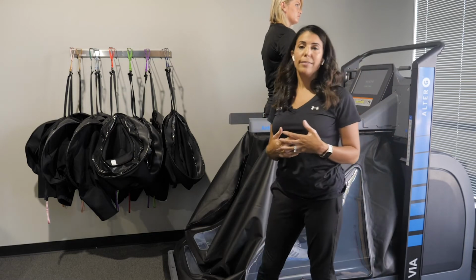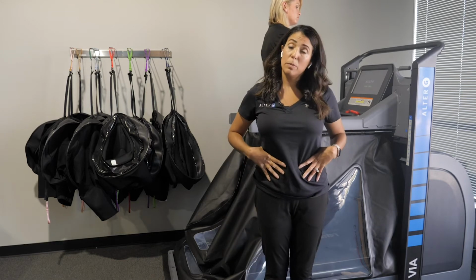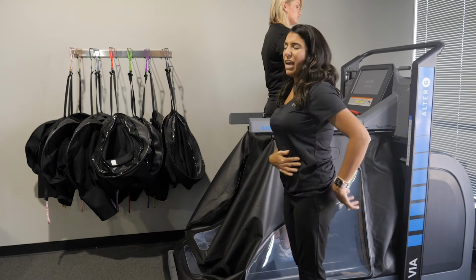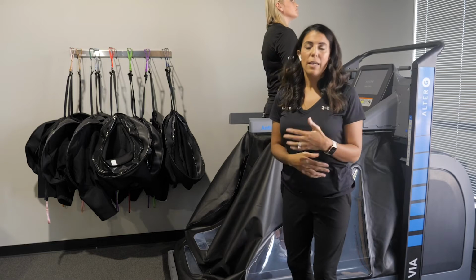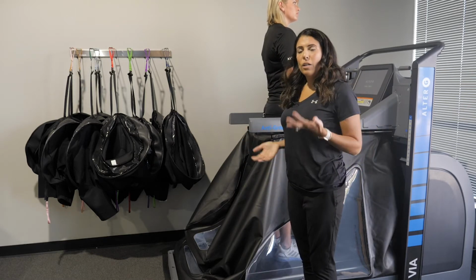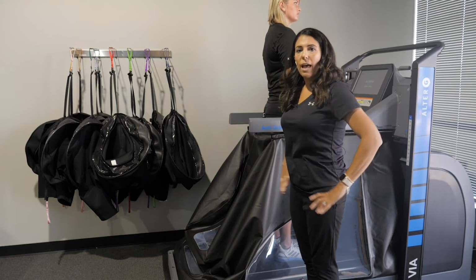If your patient has a lot of trunk instability or poor trunk control, and you want to stabilize them a little bit more, they could potentially have a lower back injury. Maybe they have a really weak core, so they fall into a little bit more lumbar extension. If that's the case, put the frame up a little bit higher, closer to the level of the iliac crest. That's going to give them more support than having it lower.